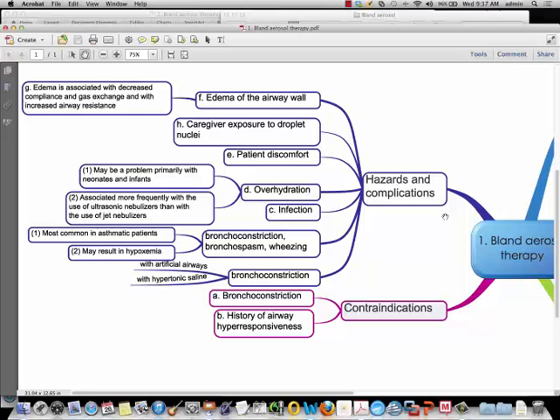So if you see a patient who's on aerosol and they were good and looked good by exam and by assessment, and an hour later they're short of breath and they're anxious and you listen and they're wheezing, it's most likely the wheezing was caused by the aerosol. But I need the caveat there, it might mean that you're accomplishing your goal too. Your goal meaning not to cause wheezing, but the other thing it has is the sponge-like effect.